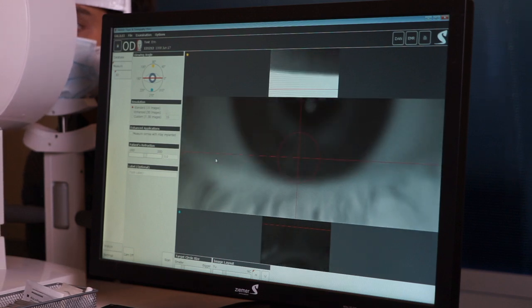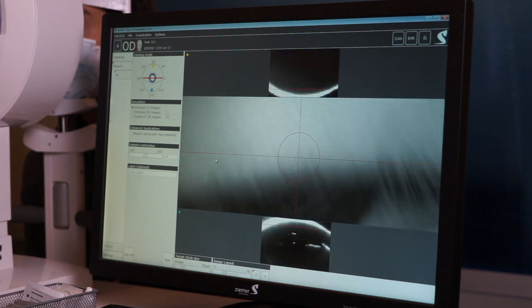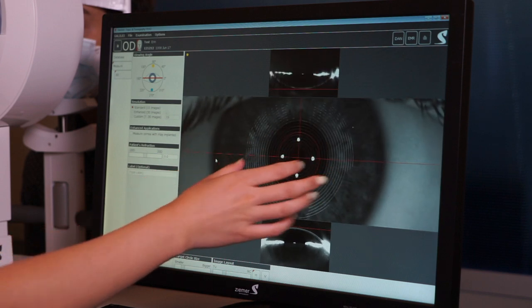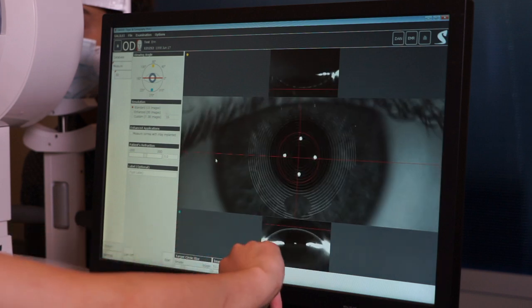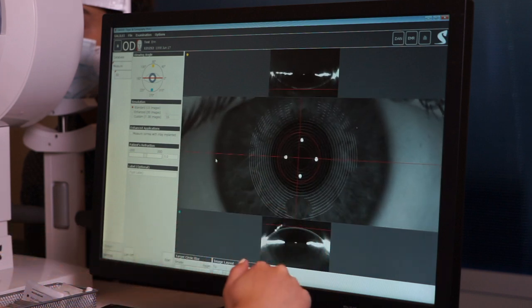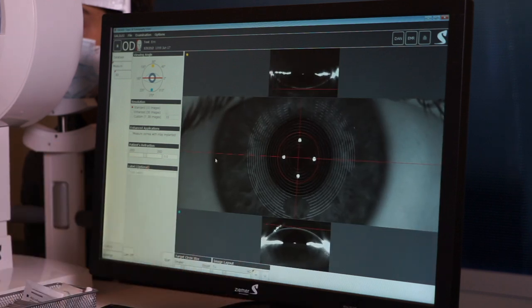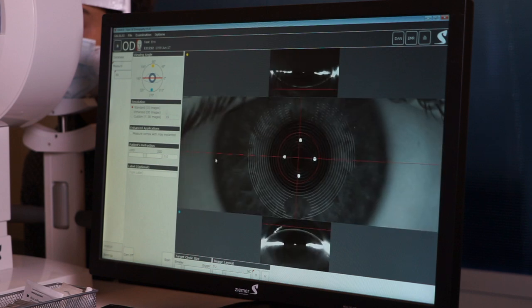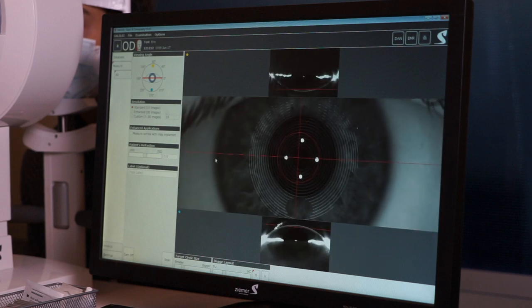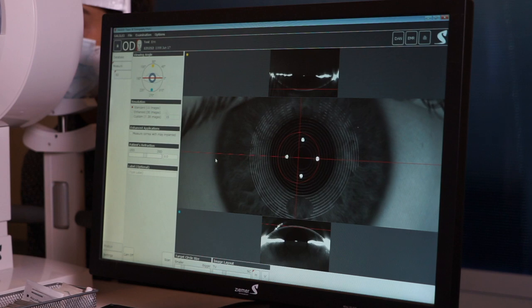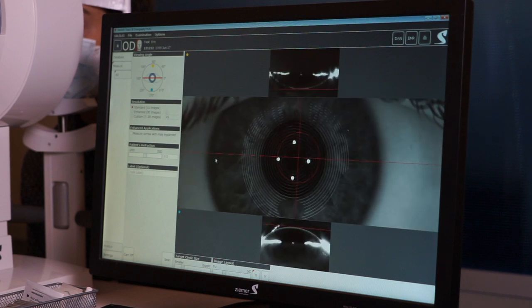They're going to be looking for a red target in front of them. To get a good image, you want to be centered on the pupil and have good alignment. You're going to want to make sure the gray band is just touching below the red line. The threshold for that is one gray band thickness behind or forward — but ideally, you want it just touching right there.